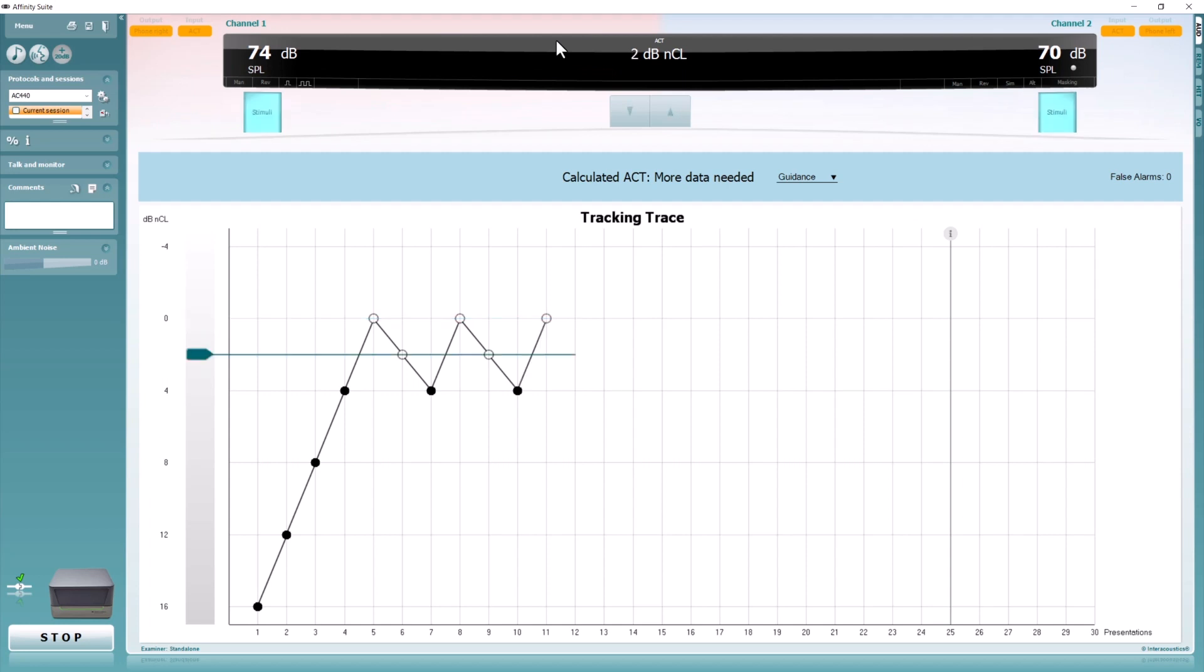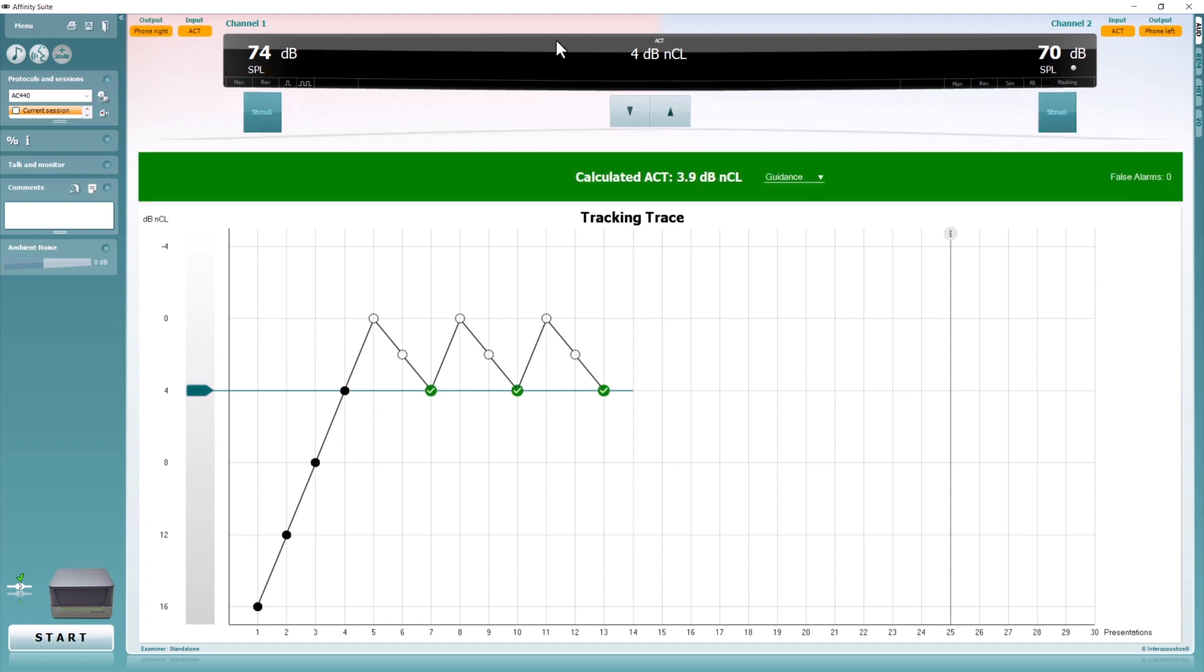Once the relevant number of correct responses has been reached to produce an ACT value, a green bar will appear in the middle of the screen. You can now use this to counsel your clients about their ability to hear in noise.